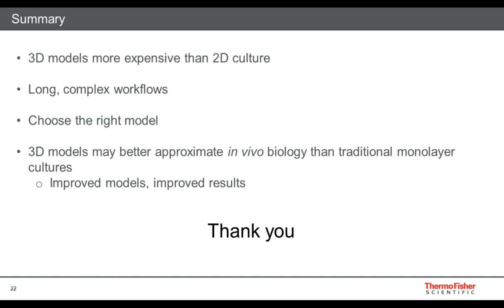And so working with cells on ice in a flow hood and those sorts of things just creates a little bit of an inconvenience, really, and may add some contamination risks that one would want to be fully aware of. So these sorts of problems are some of the challenges. In addition to that, these materials are derived from a mouse sarcoma.